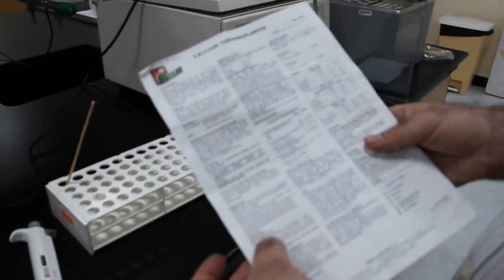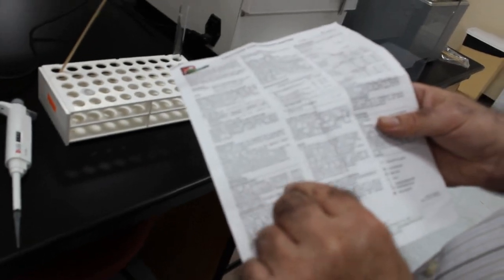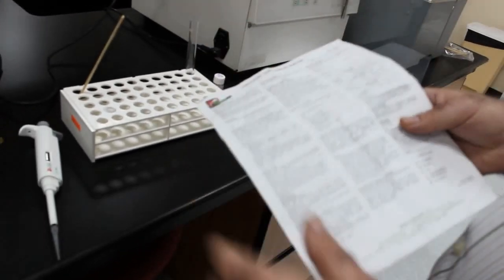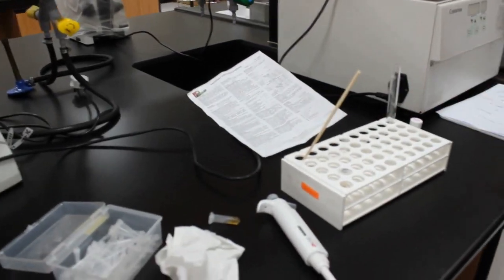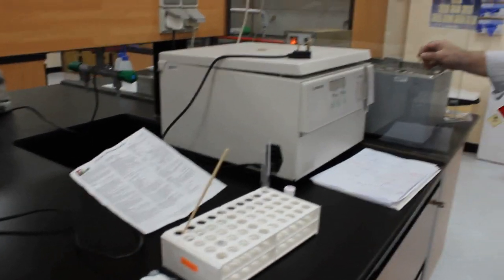It says here at 37 degrees, 100 microliter of sample, put it for 2 minutes at 37 degrees, add 200 microliter of reagent, mix and look for clot. So I'm not bringing this from my own.